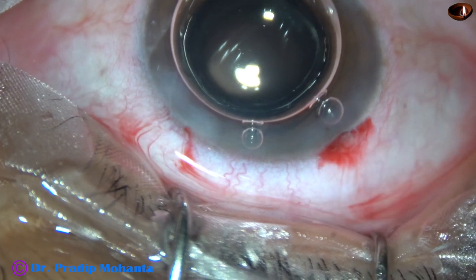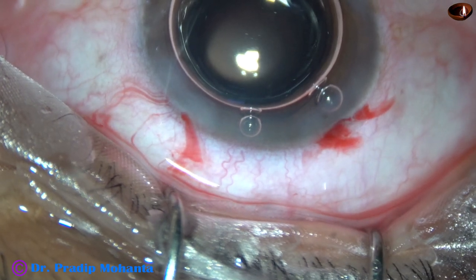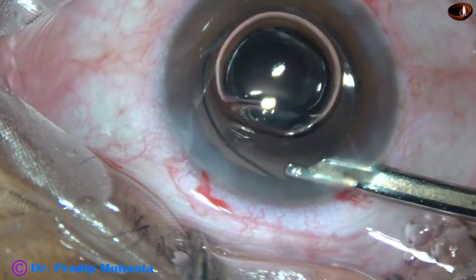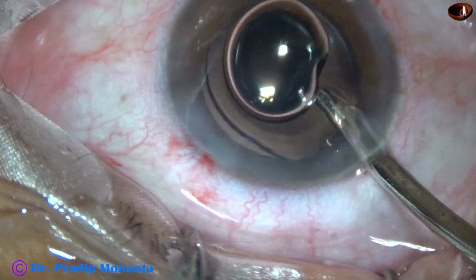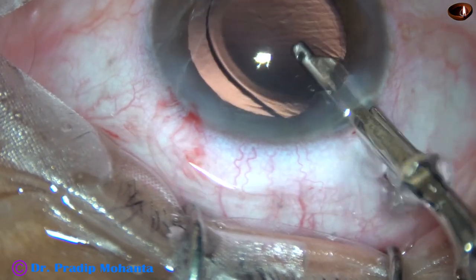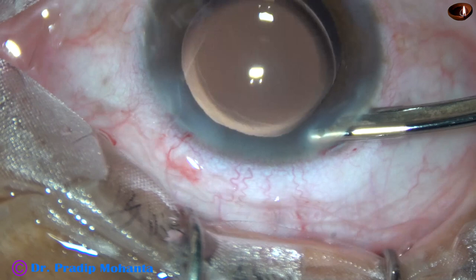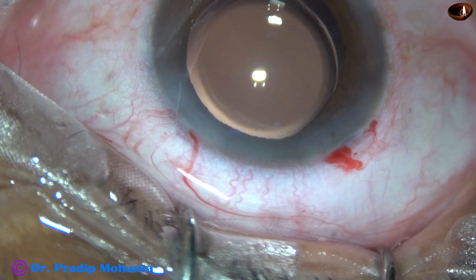We are towards the end of the surgery. I always do a final lavage of the anterior chamber, and the air bubble is replaced by BSS. The anterior chamber is nicely formed.